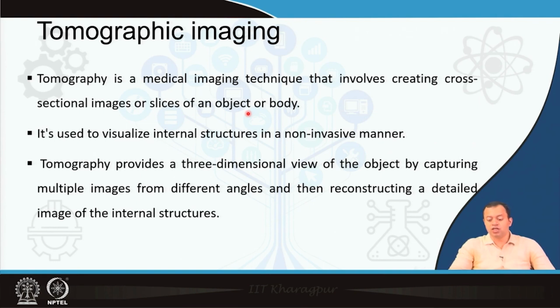Tomography is a medical imaging technique that involves creating cross-sectional images or slices of the object or a body. So, you have the targeted object from different areas. It is used to visualize internal structure in a non-invasive manner. Tomography provides a three-dimensional view of the object by capturing multiple images from different angles and then reconstructing a detailed image of the internal structure. So, you have an X-ray from here, from here, from here, and then you reconstruct a three-dimensional image.